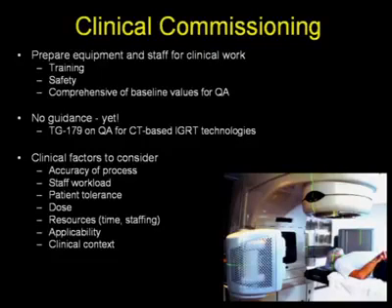outlook on the accuracy. Also, when testing things out, one must be mindful of the staff workload and ramp up clinical usage of these devices slowly but surely in order to give everyone a chance to learn the device, to get familiar with it, and also to improve efficacy with it, get faster at doing it, and trust their own judgments.